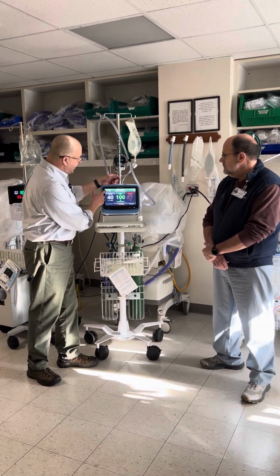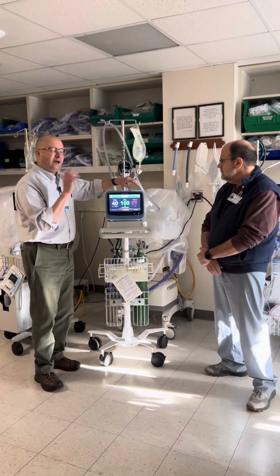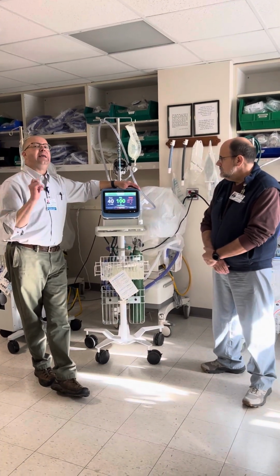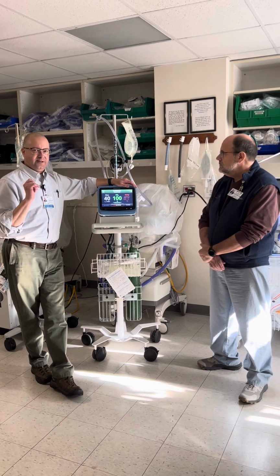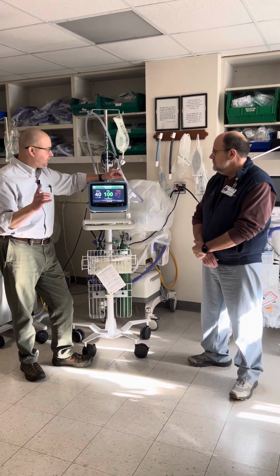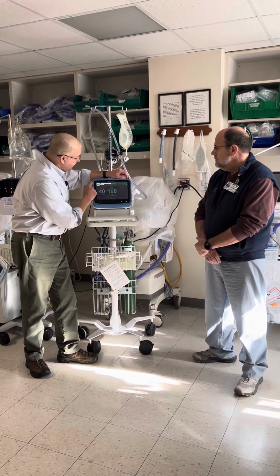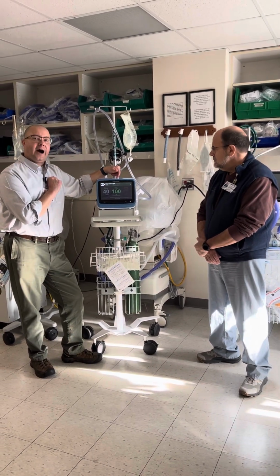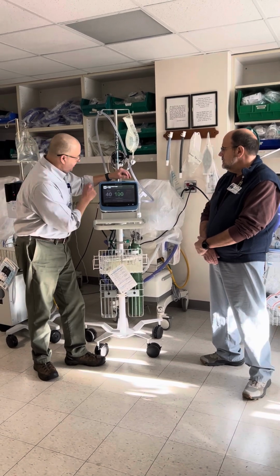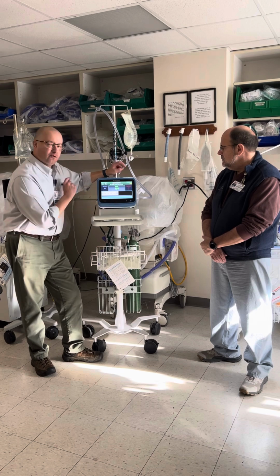There's a little lock function up here in the left-hand corner. That lock function will automatically engage after about 30 seconds. So the key to remember is if you're adjusting the oxygen, there's a little unlock function here. If you try to do it, it'll tell you that the display is locked. So if you hit the unlock target, you'll see the scroll screen come up.